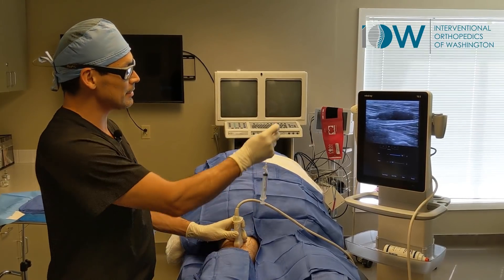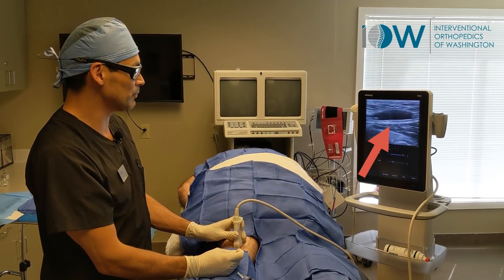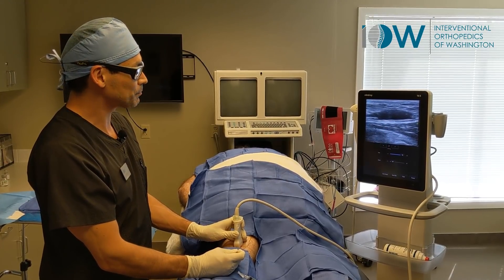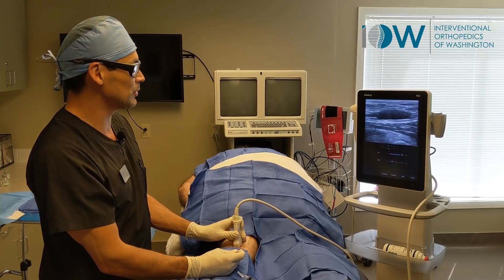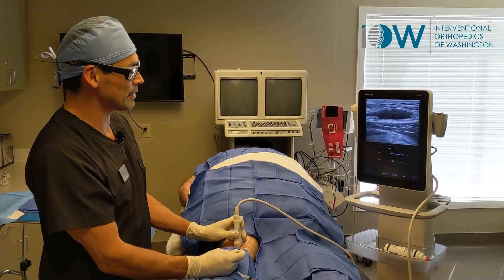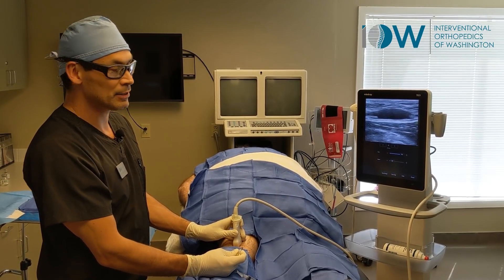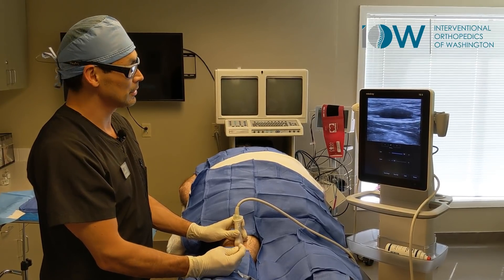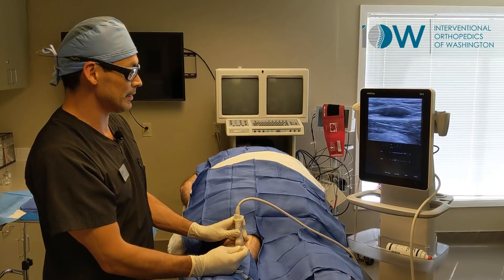Here you can see under ultrasound that there is an accumulation of fluid resulting from inflammation inside the kneecap. There's patellofemoral dysfunction, some osteoarthritis — that fluid accumulates and during exercise or increased intra-articular pressure, that fluid ends up pushing out into the back of the knee.